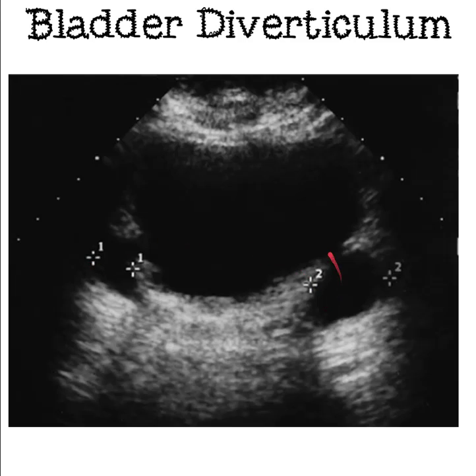Now, these are not as apparent when the bladder is empty because all of the urine does come out. Sometimes as the bladder starts to deflate, these little channels get blocked off, so we can catch some urine within the diverticuli, even though the main part of the bladder is empty. That urine, if it gets stuck in there, that urine stasis can cause problems. It can cause inflammation. Particulate can start to form, so we might start to see some debris within the bladder if the bladder does not empty completely.